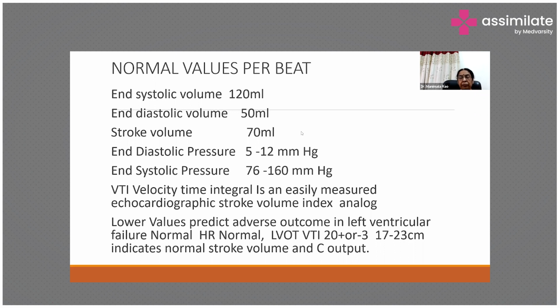That's the normal thing. So if you know these pressures and you know the volumes, then you can easily make out whether the volume is more or less. So you can find out by looking at the size of the ventricle and its end diastolic volume. You can say whether there is enough volume or more volume. Do you require to give a fluid, or don't you require to? Even that is possible. Once you know it, that's why you have to learn it.